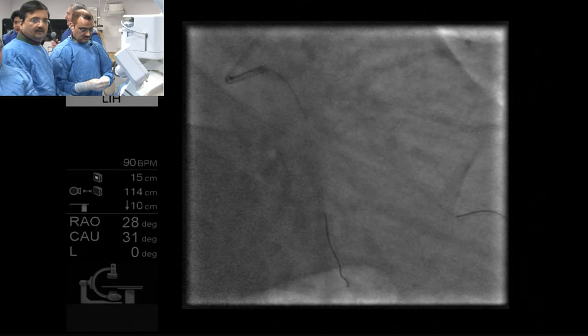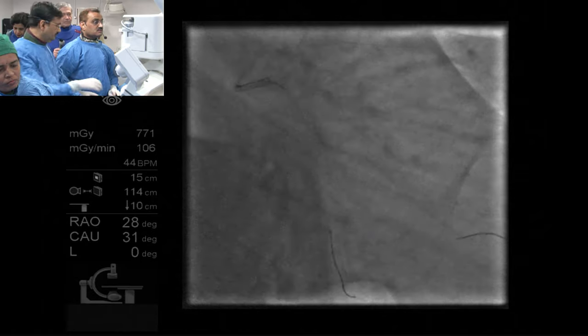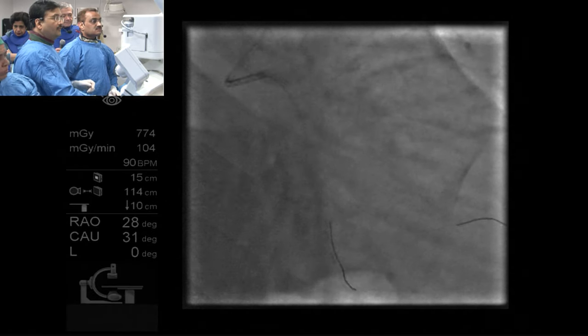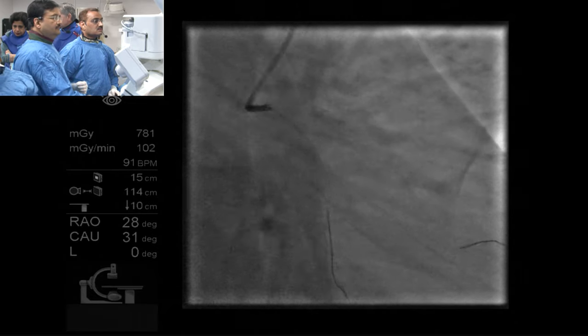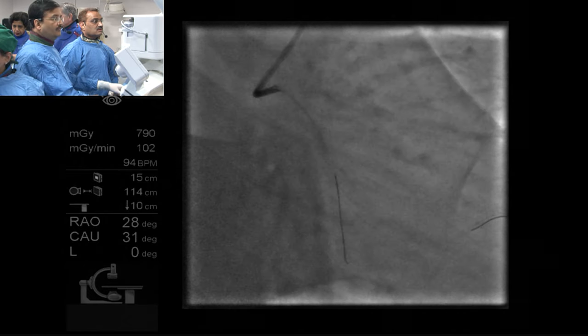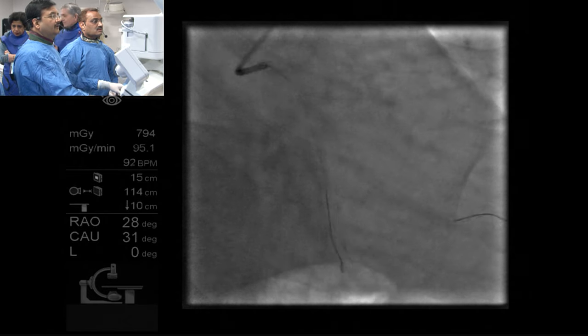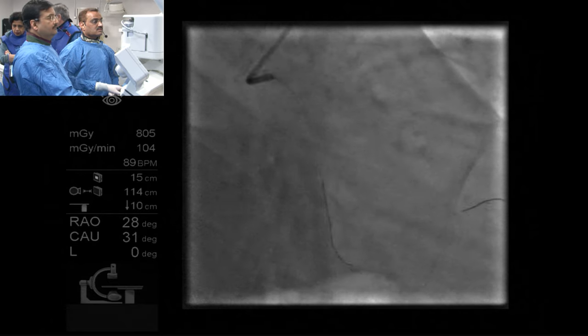Yes, describe that. So you insert a side branch wire, and you put a balloon in a side branch. Yes. Actually, I do an uninflated balloon. I don't inflate it in a side branch. So you inflate the main branch stent, but the balloon in a side branch maintains a lumen, so you don't close the side branch totally. And you initially deploy the stent at a very low pressure, and then you remove that trap.